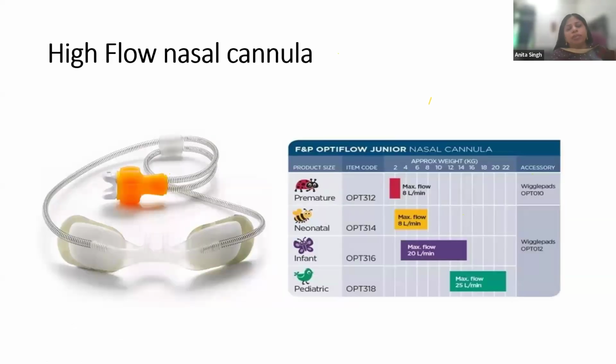So, regarding high flow nasal cannula, we talked of nasal cannulas in the oxygen, simple nasal prongs or simple oxygen prongs. The important point in the heated humidified high flow nasal cannula system is that it has to be heated, it has to be humidified, and it has to be high flow. So the three H's have to be understood whenever we want to understand the principle of HHFNC. For the HHFNC, the diameter of the nasal cannula is very important: it should occlude around 50% of the nasal aperture of the baby in which it has to be placed.